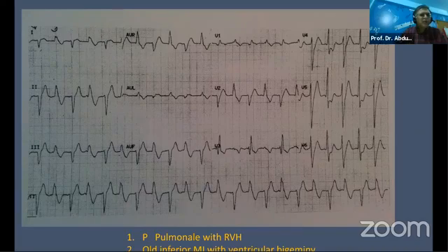So could it be a VT? And this is a recurring event. That means it's a bigeminal event. So are there two types of problem? One is structural, another is electrical. That could be it. Now, why can I get very well-formed QRS complexes?